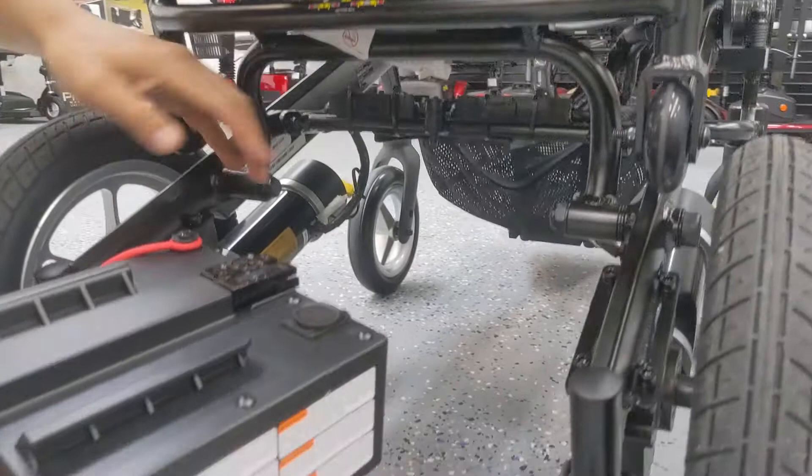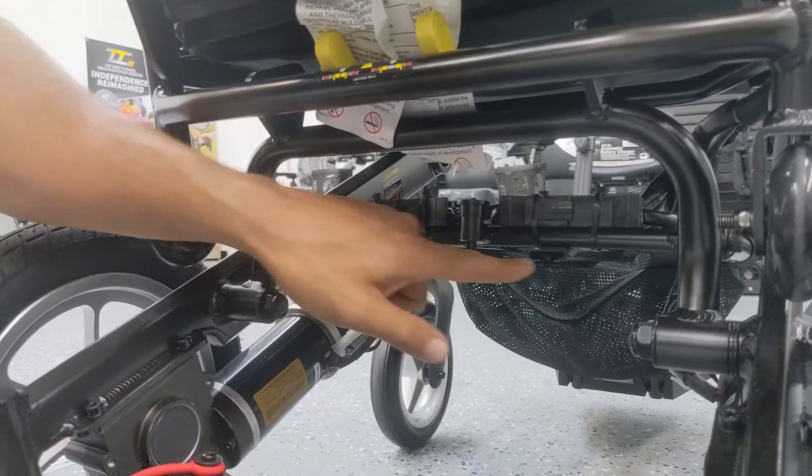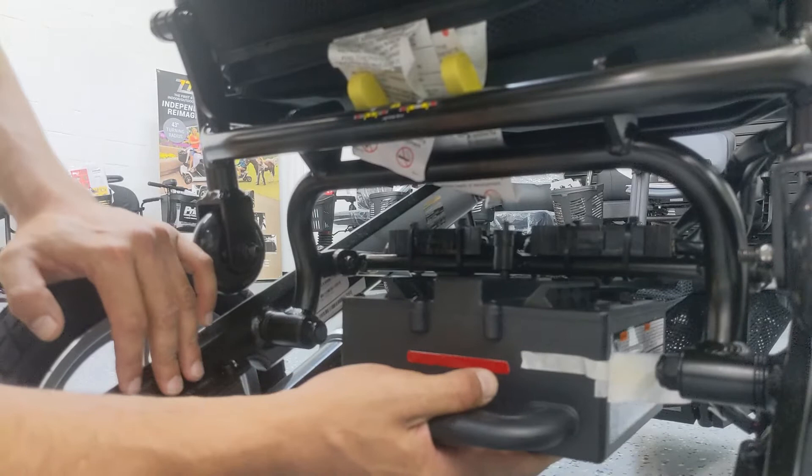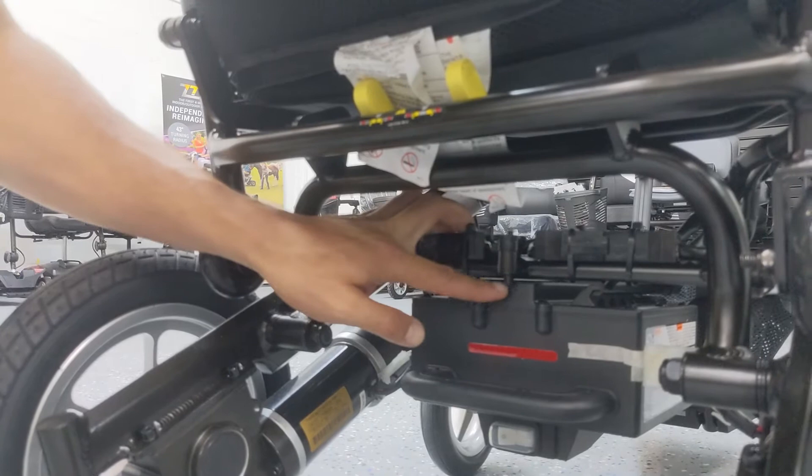Putting the battery back in is done the same way. You push that button up. There are two rails and corresponding slots for the mounting rails. Basically, slide these two rails into the slots, get it positioned, and then slide it all the way back until that button pushes down. And we're good to go.